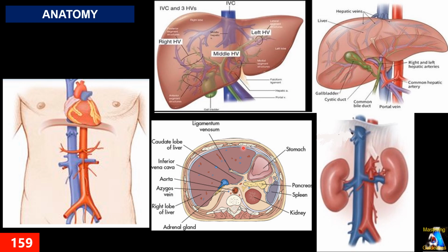But remember that below the left lobe of the liver we have the stomach, as you can see here, and the transverse colon passes through this area. These two structures are usually full of gas, and in some cases we have a hard time getting an acoustic window at the midline. Otherwise, in most cases, because of the liver, we have a good acoustic window at the midline.